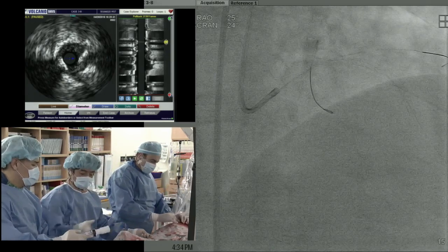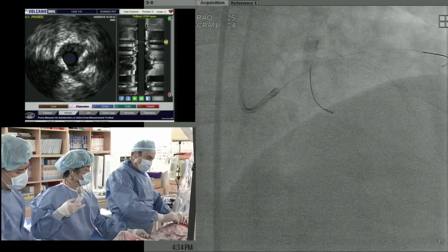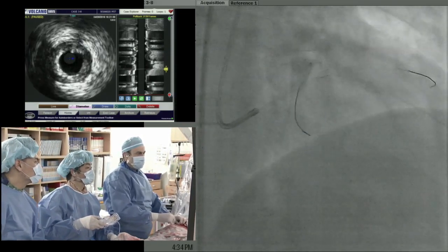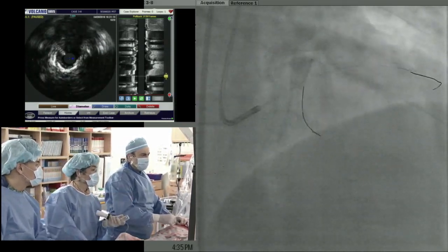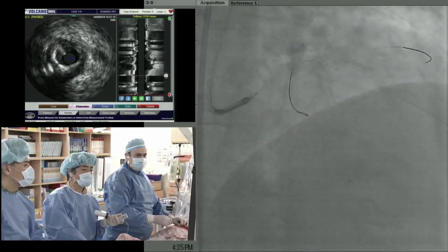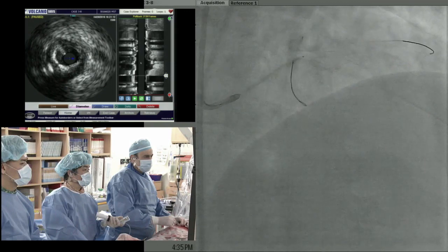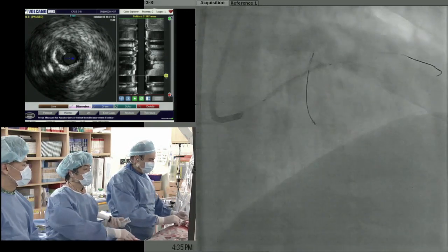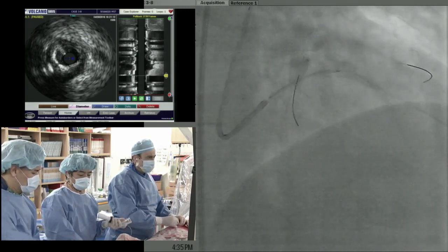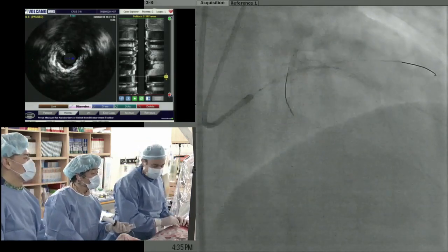So you plan to do a full metal stent? I'm going to do a crossover. The left main has plaque, so I'm going to try to take it almost to the ostium. Plus the true ostium of the LAD is right here. Yep. So it's not exactly a good landing zone. Yeah, I think trying to nail the left LAD ostia, you don't do it. If you really try to nail it, you miss it most of the time. Little test, please. Let me go a little.